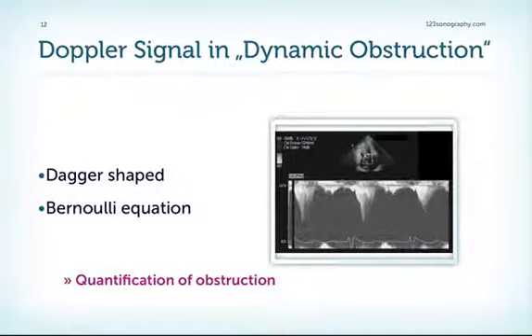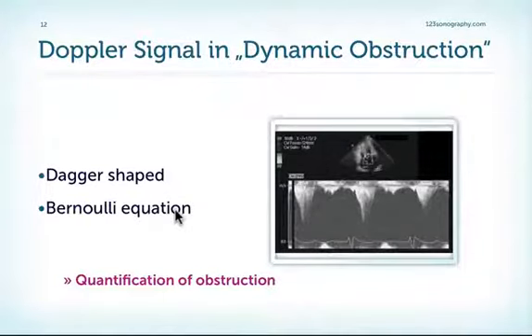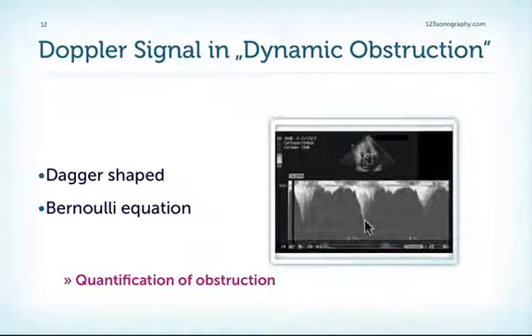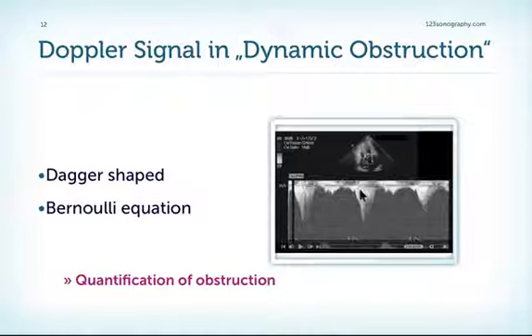We also find another typical sign: with continuous wave Doppler of the LVOT, we can see an increased velocity, which reflects the gradient. You can quantify gradients with the Bernoulli equation. You also see a typical shape of the LVOT signal — the shape of a dagger. Remember, obstruction of the LVOT has a different signal than aortic stenosis; we have a dagger shape, which is typical for this pathology.